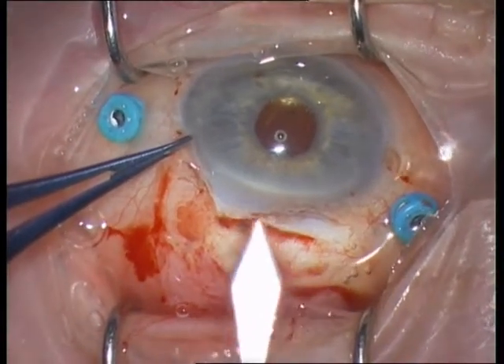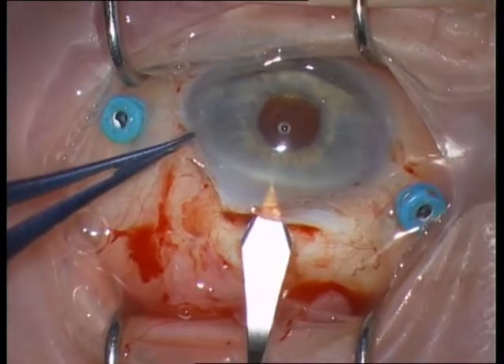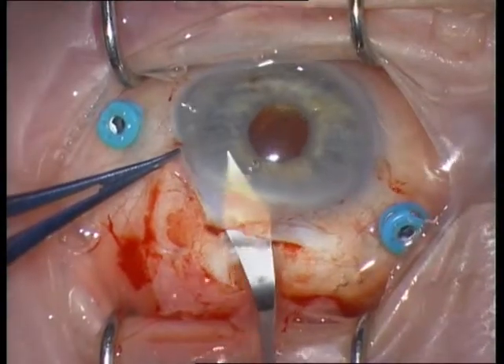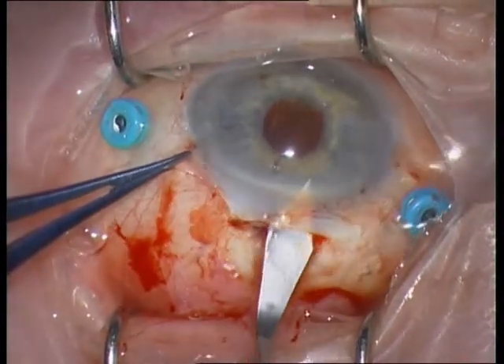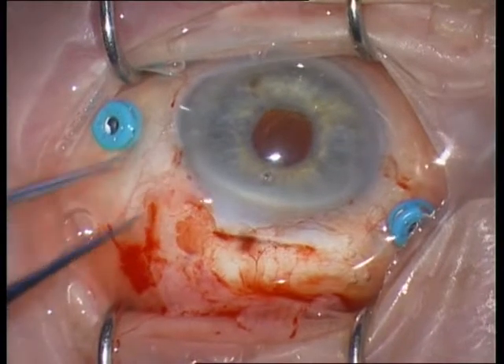Take a 2.75 mm blade and open the anterior chamber. It is a U-shaped incision, not a V-shaped incision.